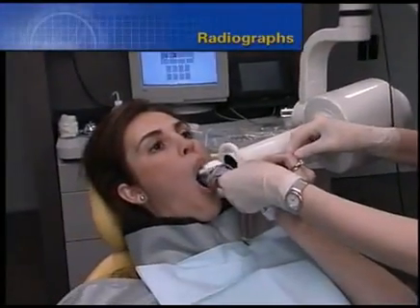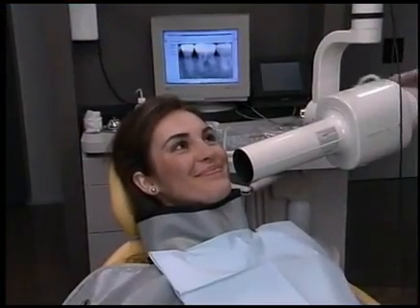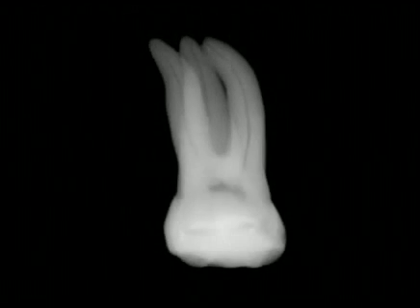Clinicians should take 3 well-angulated radiographs prior to initiating treatment in order to better appreciate the three-dimensionality of any given tooth. From an endodontic standpoint, preoperative film should include mesial, distal, and straight-on angles.